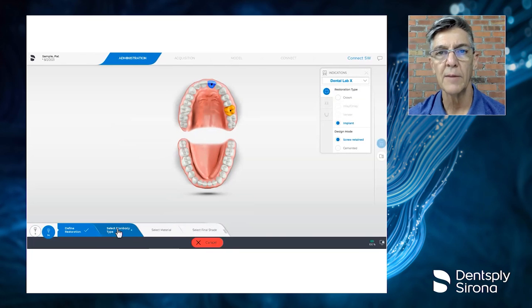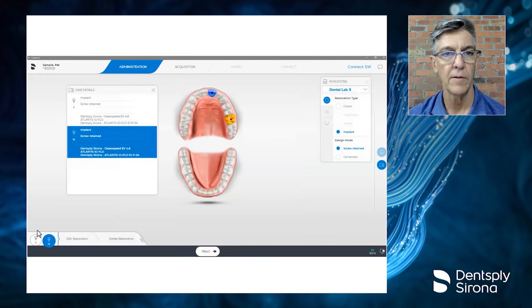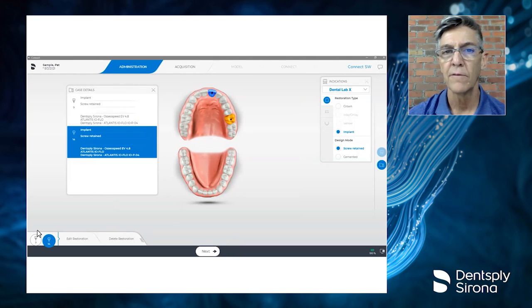So the next step is to choose the scan body. And for the particular type of implant you are working with, in this case, a Dentsply implant, this is an OsseoSpeed, I have chosen a particular scan body. And I click OK. Now, the program in Sirona Connect is going to default to apply the same scan body for each site chosen.